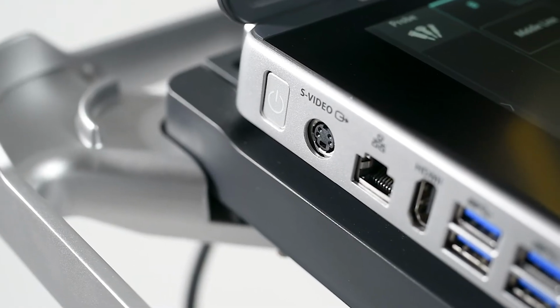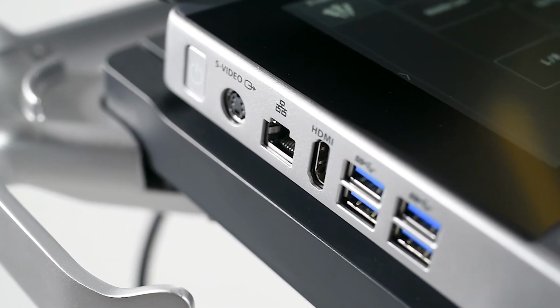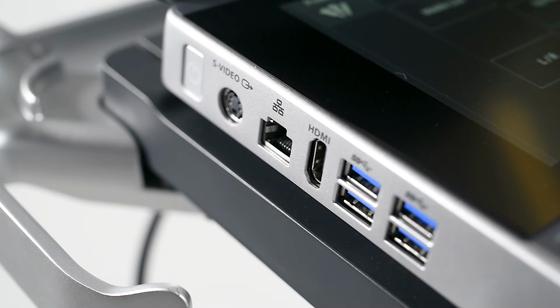On the left side of the system, there are ports for the following: S-Video, Ethernet, HDMI, and 4 USB ports.